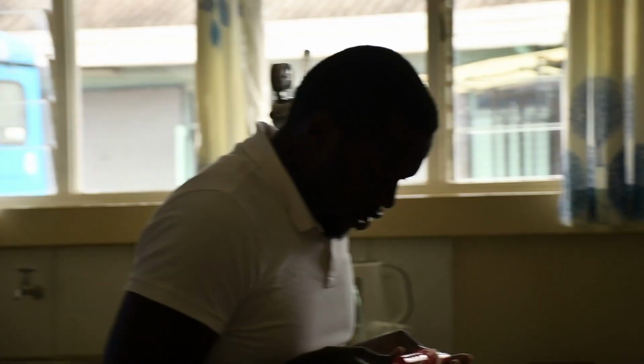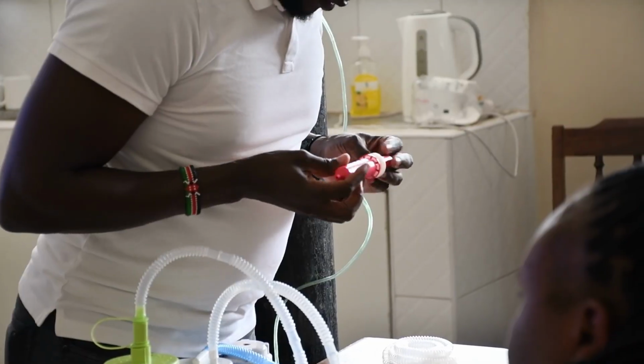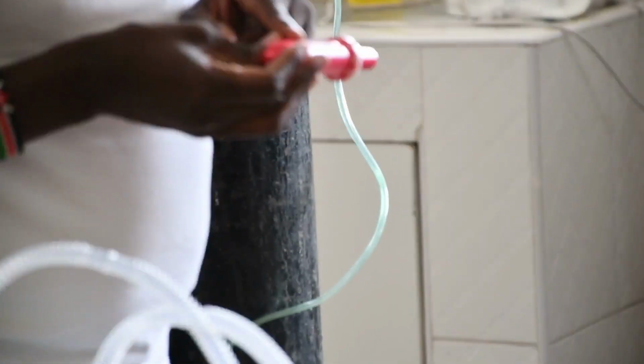Now let's go ahead and try to close it. Go back until your indicator here goes to 100%. Close it all the way. This is the indicator.